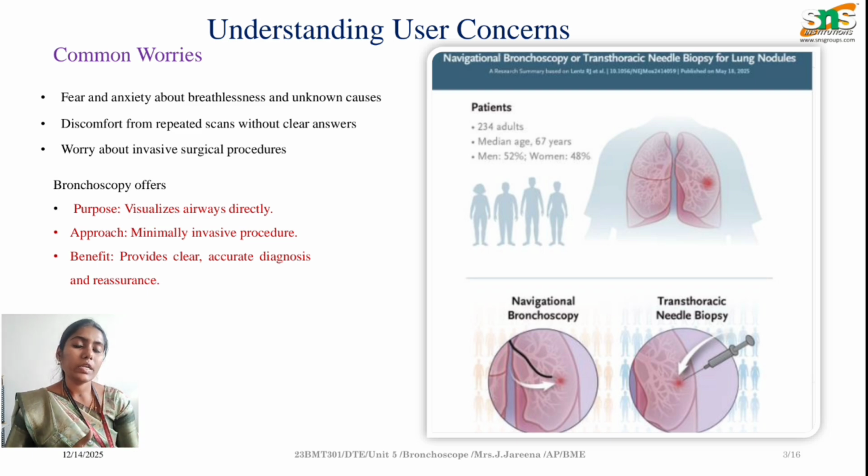It is for patients who have breathing problems. There are certain cases where people have difficulty in breathing without any apparent reason, in unknown cases. It is very challenging to diagnose the particular problem with the help of traditional techniques like imaging modalities: X-ray, ultrasound, CT scan, and so on.